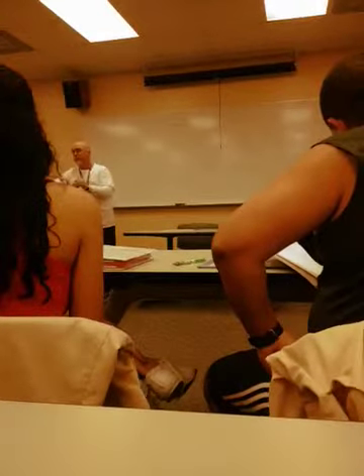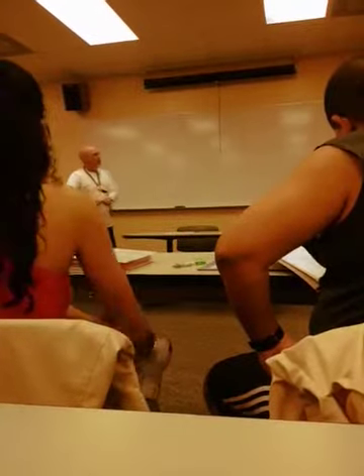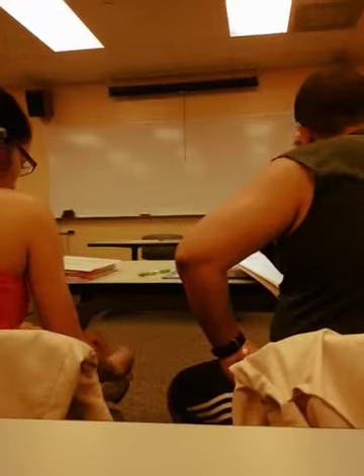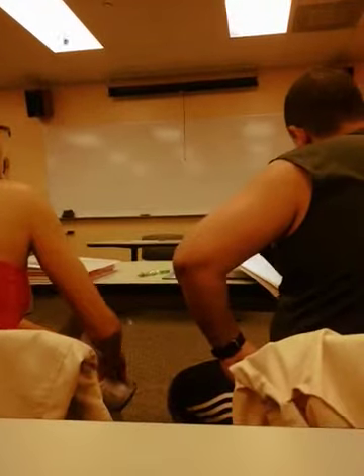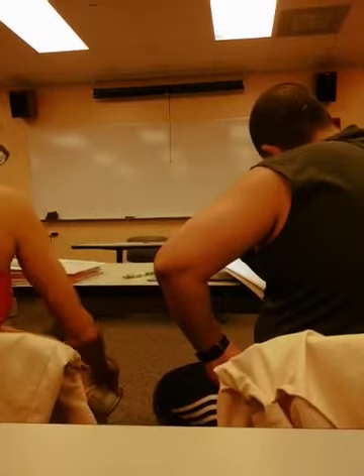She was Israeli trained. She would measure cervical motion rotation, and rotation only, using a goniometer. That's not good or bad, but I'm trying to give you an indication of what it looks like. The rest of the places I've been and worked with, cervical range of motion and lumbar range of motion, it's reported as a percentage of 100%, if you will, or on a diagram that looks like this.